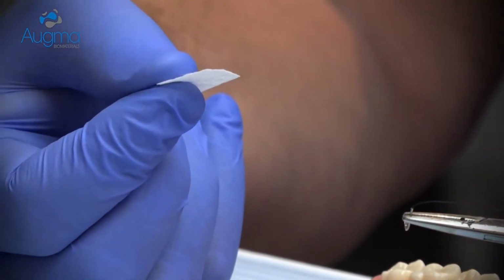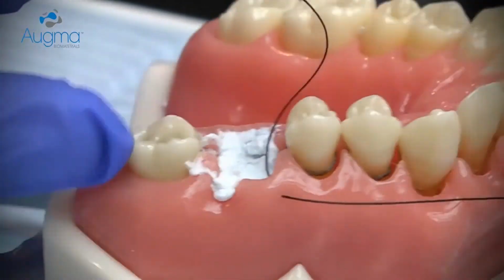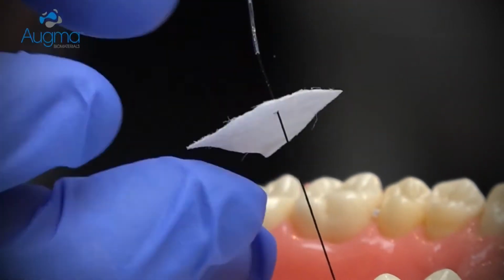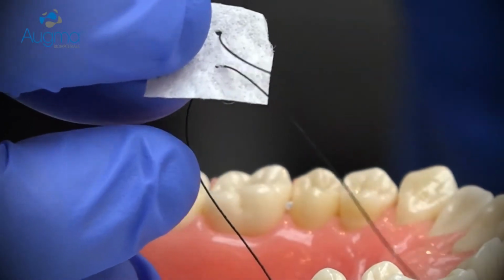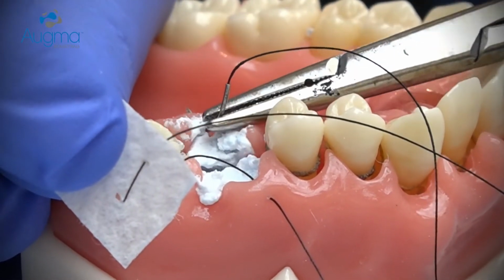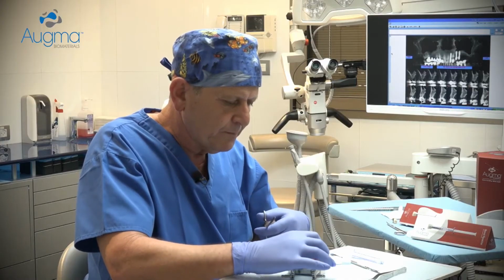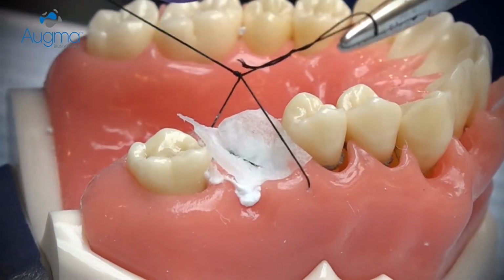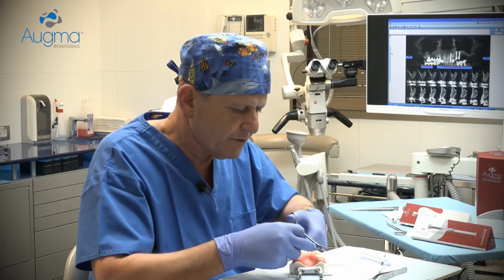Hold the collagen sponge in your hand, insert the needle from the buccal aspect, insert it to the bottom of the collagen sponge, and from up to down, insert the needle into the lingual aspect, and place the sponge above the grafted site and make your first suture to stabilize the collagen sponge in place. Now remember that the collagen sponge must be stabilized together with the soft tissue by its first knot.